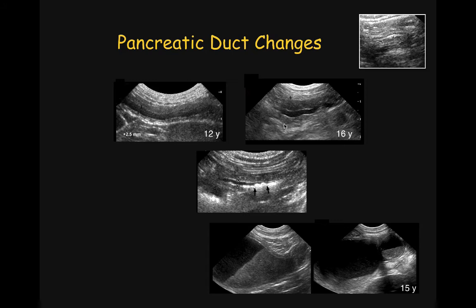In these cases it may be difficult to use measurements as a useful feature to assess pancreatitis. We need to also look at the contents of the pancreatic duct. In this case we see the pancreatic tissue of this left lobe, and the pancreatic duct has a prominent wall. In addition, we see the presence of intraluminal sediment and small calculi that are partially mineralized and associated with shadowing. At times we may encounter a hugely dilated pancreatic duct, like in this 15-year-old cat presented for progressive inappetence. The markedly dilated pancreatic duct contains also partially settled cellular fluid, and no calculi were seen; the etiology of such changes is often unknown.